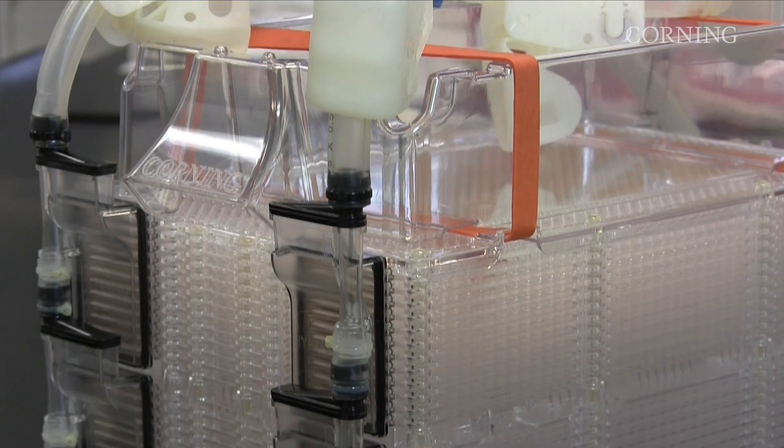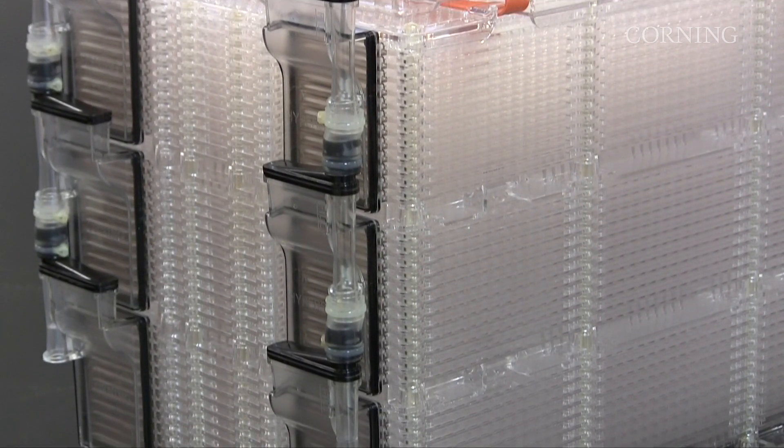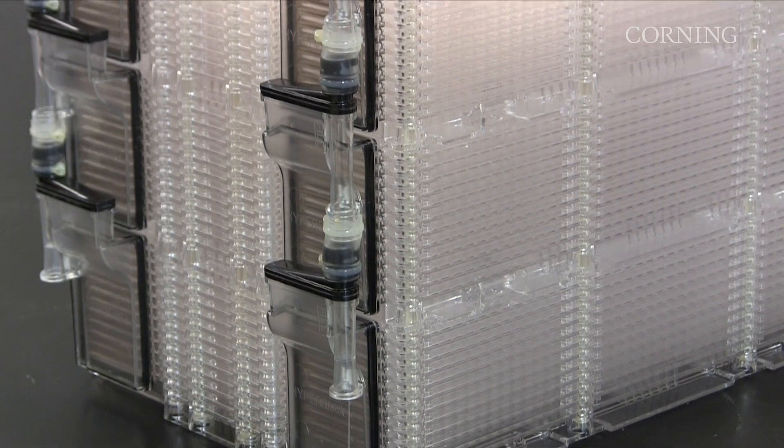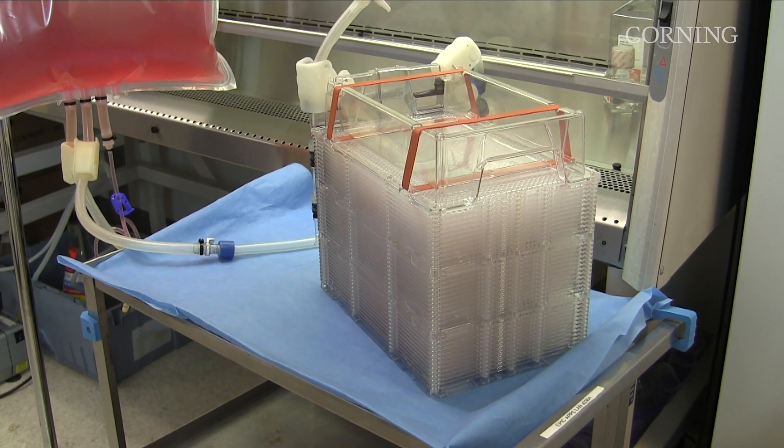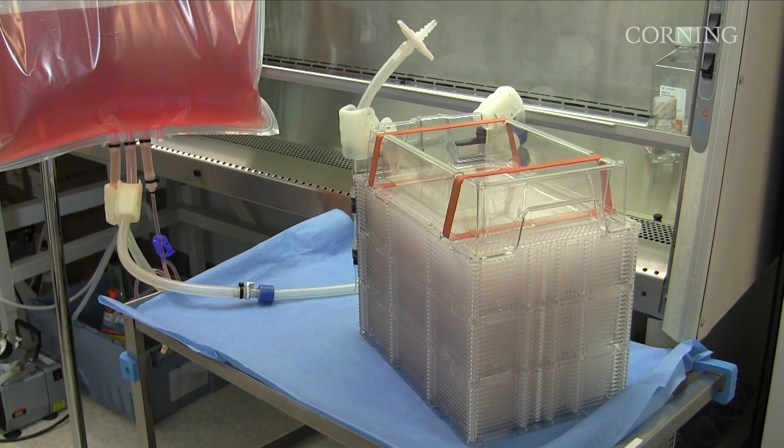As a result, the 12 and 36 layer Hyperstack vessels have the same spatial footprint as traditional 2 and 10 layer stacked culture vessels. In this video, we will demonstrate the recommended procedure for filling and emptying a single Hyperstack vessel.